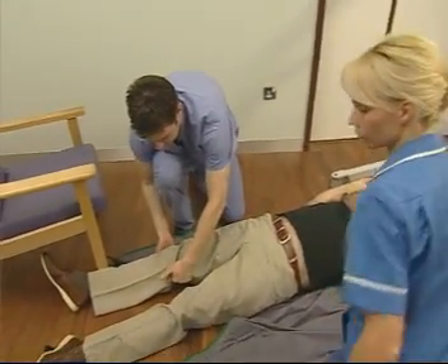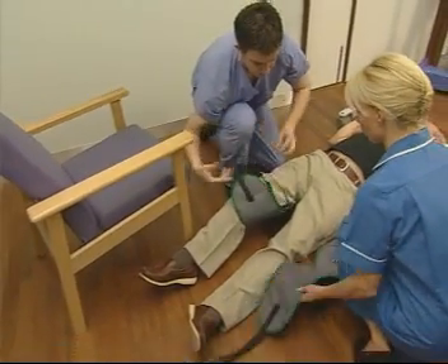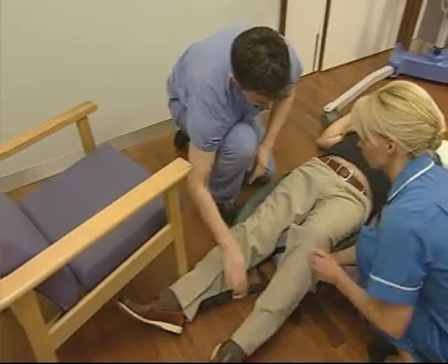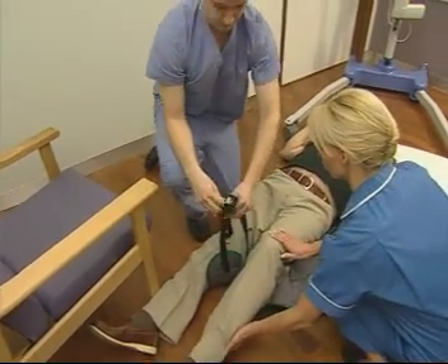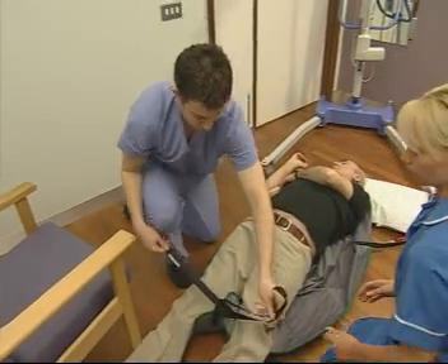Using good posture, move to the leg pieces and tuck them under each leg. Crossing them will keep the legs together and maintain the dignity of the patient.